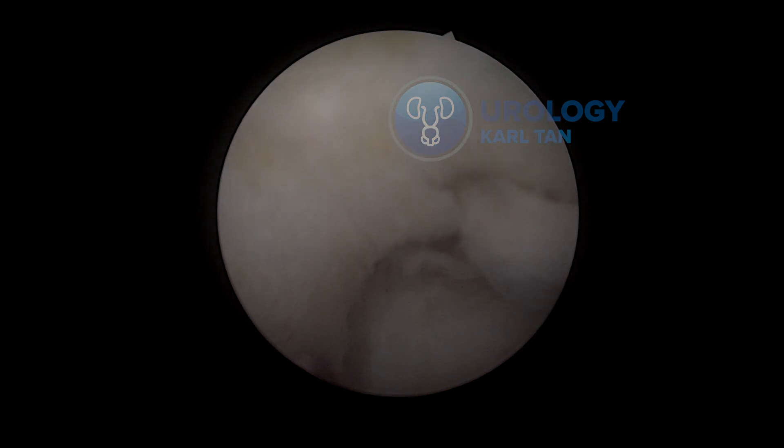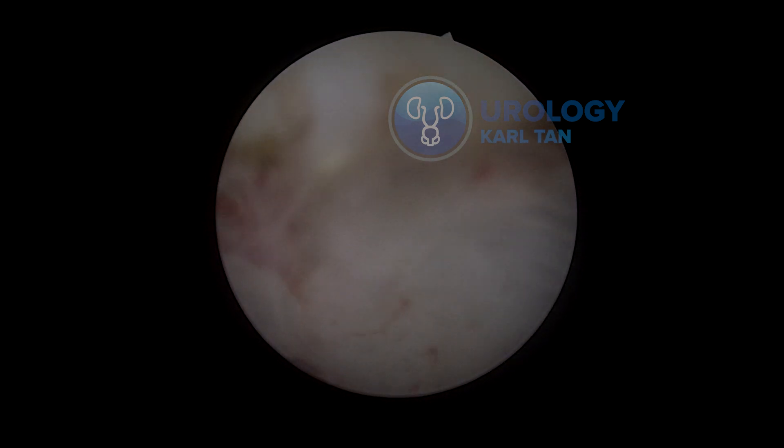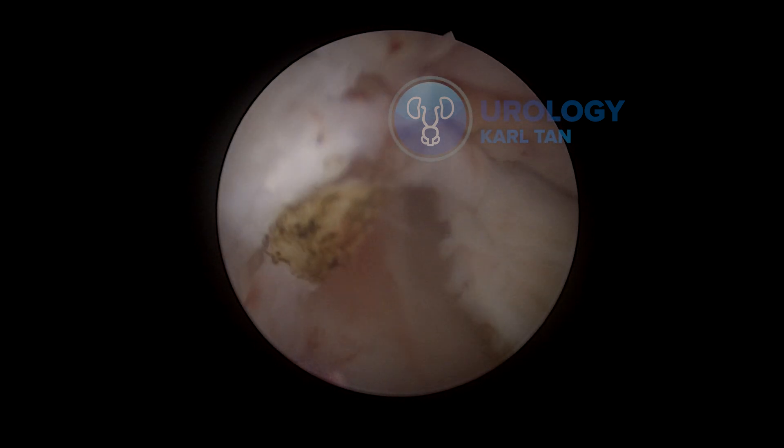That would be your guide in doing the procedure. It's quite a good video to teach, but it's not always like this. You would also find some cases that would be difficult, like giant prostates, or sometimes we encounter known prostate cancer cases.